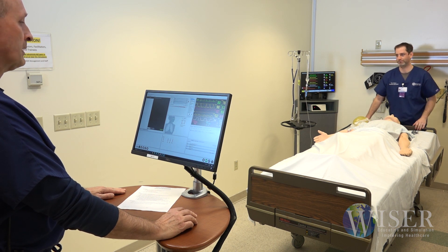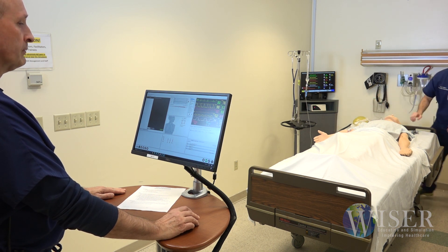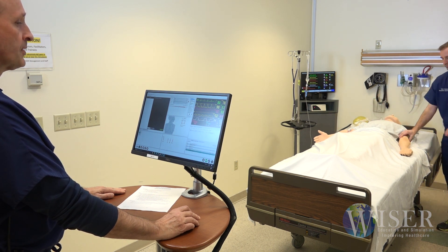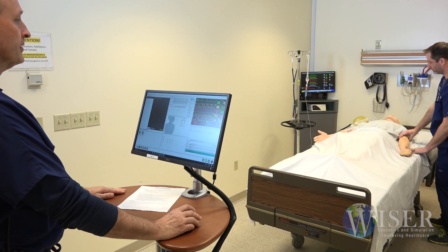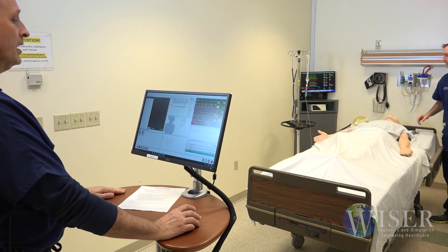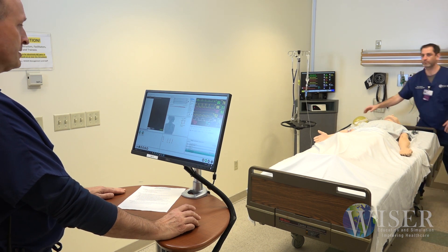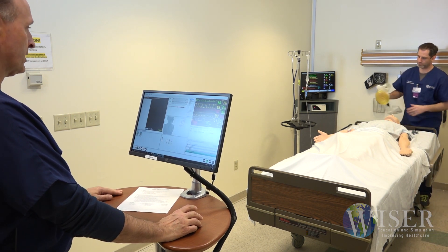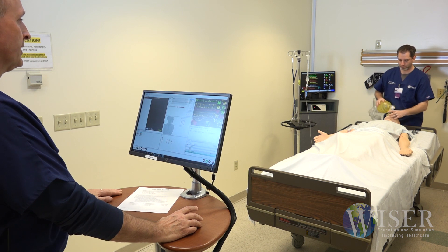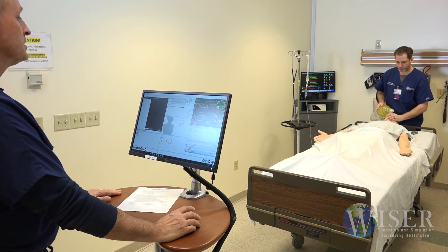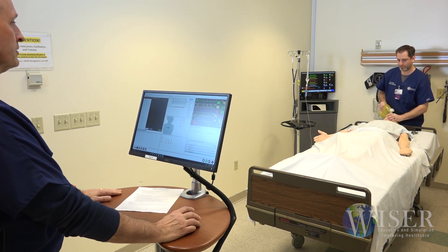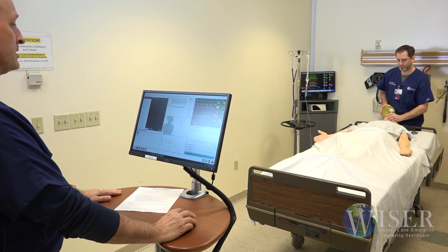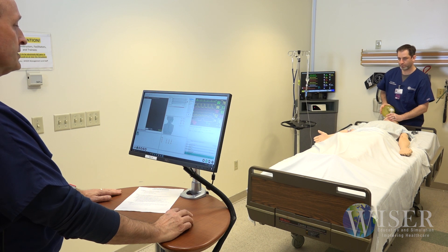The patient is breathing. We then stop the patient from breathing, and the sim specialist I'm working with goes ahead and ventilates the patient. Good chest rise is confirmed.